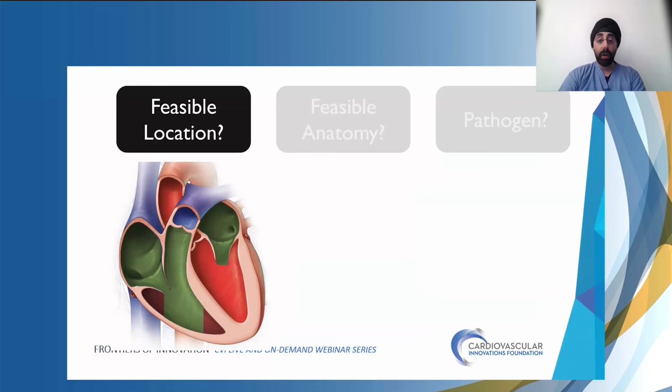I think for the couple of operators we have on the line here, left-sided can also be approached successfully. I think there needs to be a little bit more expertise with that. And you can go from a transseptal approach if you're going to the mitral valve. You can go retrograde if you're going to the aortic valve. And so I think maybe Abdallah or Paul can comment more on some of the left-sided work that they've done. But you want to understand, is this something that you have the skill set to approach, and how you're going to approach it?